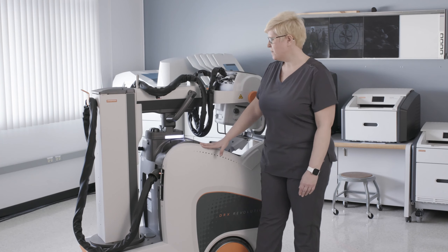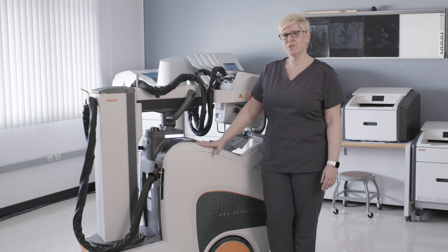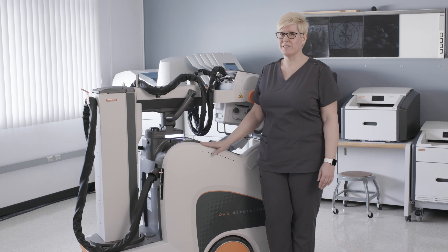Hi, my name is Jen Twaits. I'm the applications engineer here at CareStream, and today I want to talk to you a little bit about the DRX Revolution mobile x-ray system.